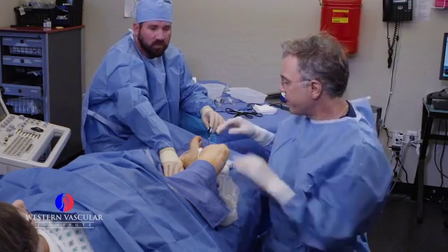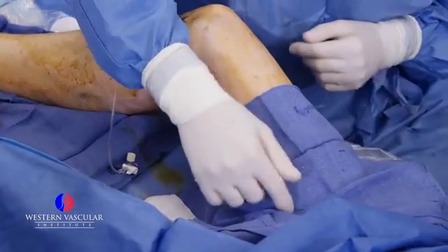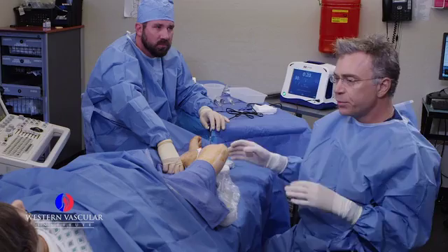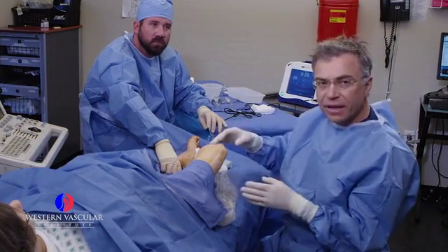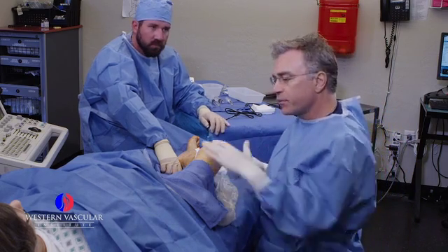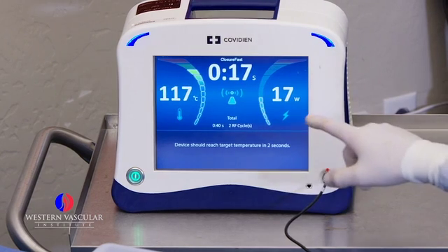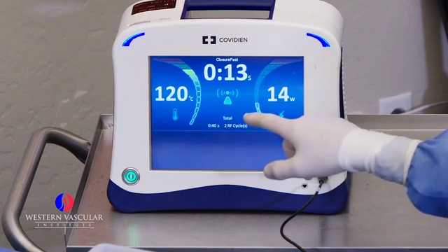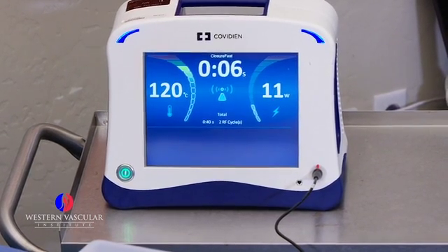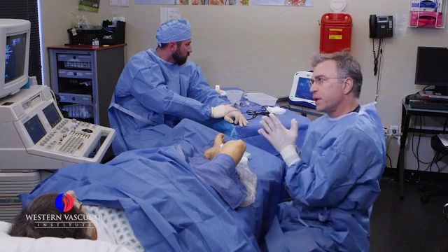We have the radiofrequency ablation catheter going through the entry sheath, positioned up at the groin level. We're going to heat little segments of the dilated incompetent saphenous vein all the way down to the level of the knee. We put the patient's head down and elevated the leg to empty the leg veins so they collapse a little and make contact with the catheter. Here you see our machine connected to the catheter, generating 120 degrees Celsius at the tip of the heating element, essentially damaging the internal layer of the vein. When we're done, the vein itself will be clotted off and closed.